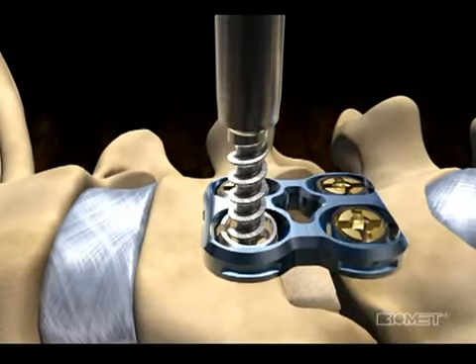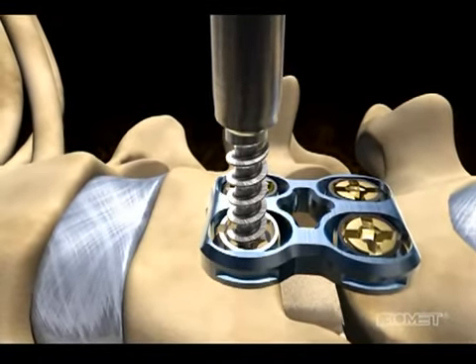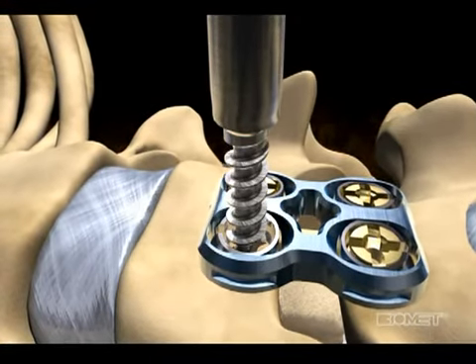Confirm that the slot on the ring is oriented in the cephalad-caudal direction once the screw has been removed. If it is not, discard the plate and use a new one.